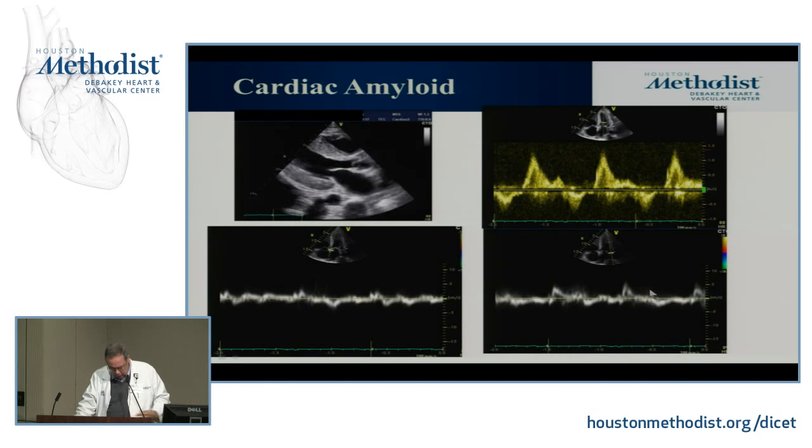Now, it comes in all kinds of gradations. This one, you can see severe impairment of the E prime with already a pseudonormal pattern. So this patient is in a much more advanced stage.